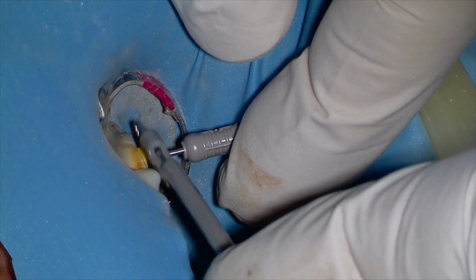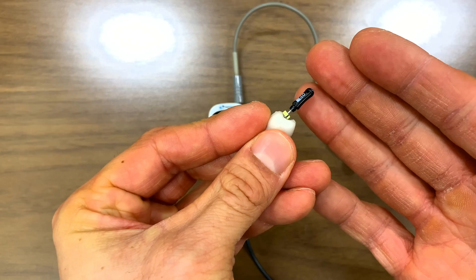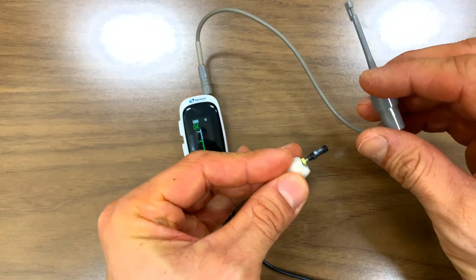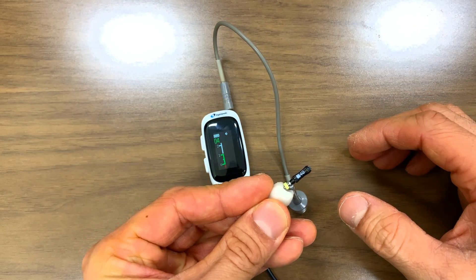Ever gone to use your apex locator and it doesn't register on the machine — and you think, oh my gosh — and you're knee deep in a root canal? You've just completed your access in your tooth, you're about to get your working length, you've got your apex locator fired up, you go to place your file clip, and boom — nothing.